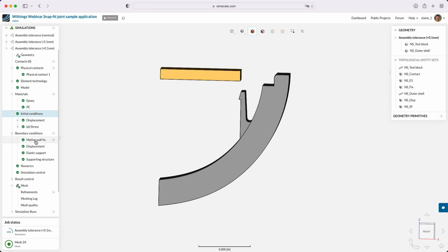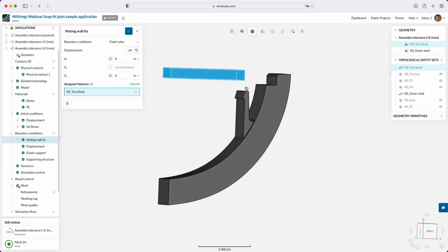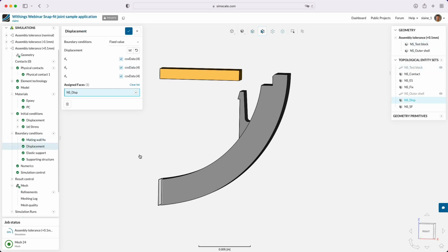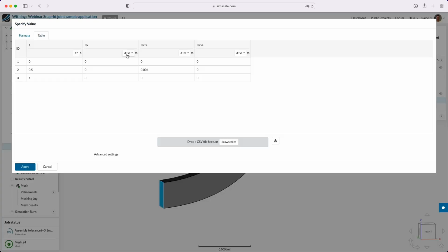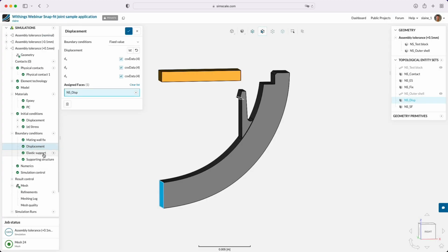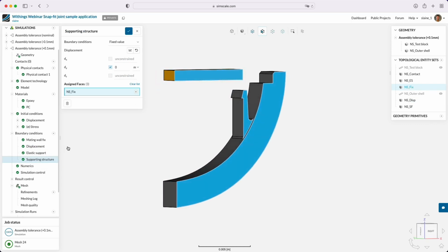And then we've got the boundary conditions. So we've fixed the base plate here for snap assembly in position, and we're assigning the displacement to the mating part, and that in this circumstance was done using a table. So we've defined over time at 0.5 seconds it will insert 0.004 meters in the Z direction, and then it will extract at 1 second. And then we've got some elastic support and supporting structure that simulates the remaining structure that constrains these parts in place.